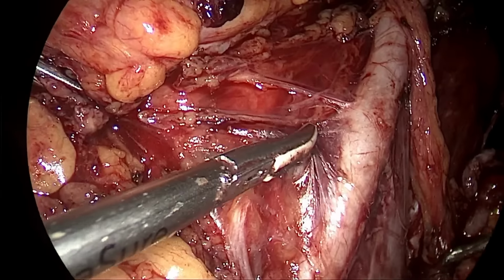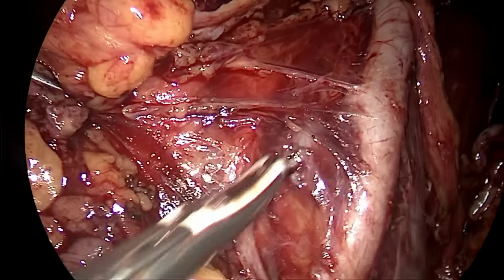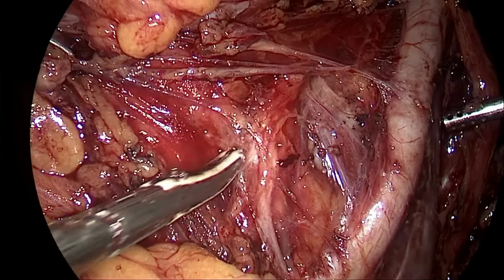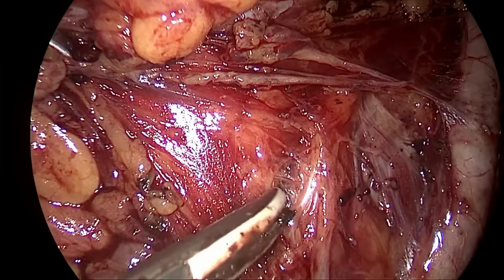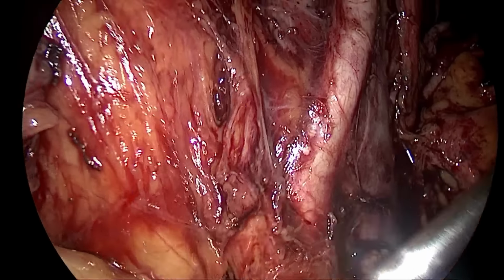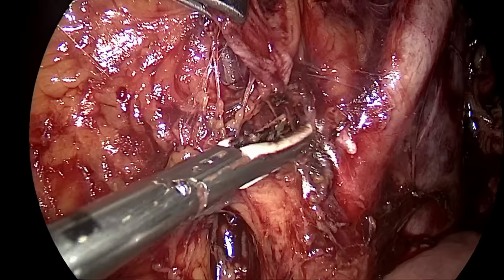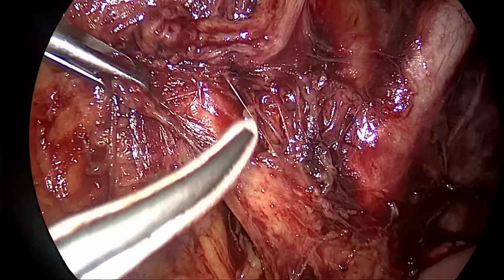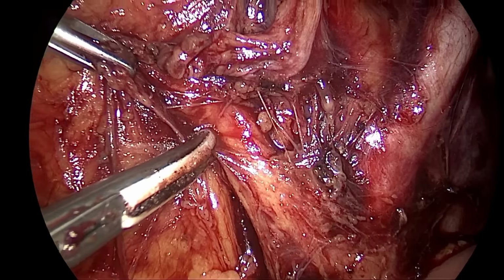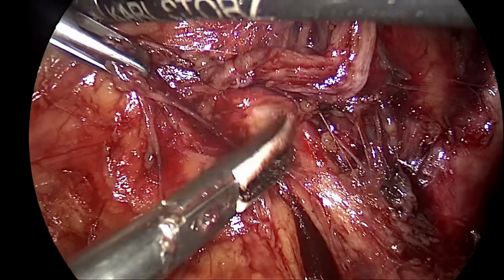After that, we have again moved towards the iliac bifurcation. So below my ligature will be the left common iliac vein. I'm trying to skeletonize the left common iliac artery. So that's the aortic bifurcation. So from this side we will approach the left para-aortic node, the remaining nodes.